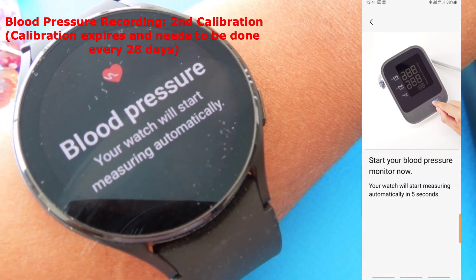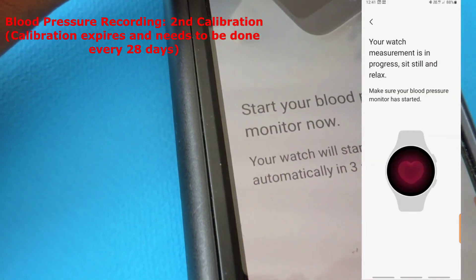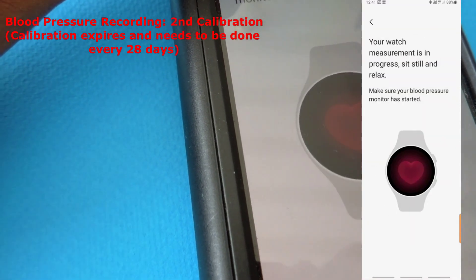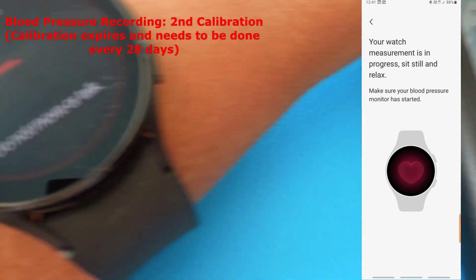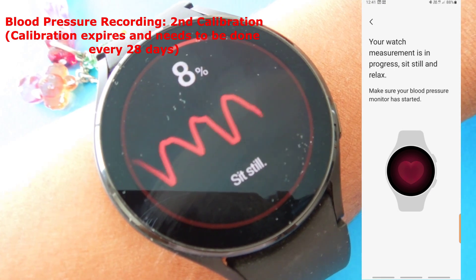Now I'm taking my second reading. The watch will start measuring automatically, and I've started my blood pressure monitor. It has started measuring my blood pressure for the second time.